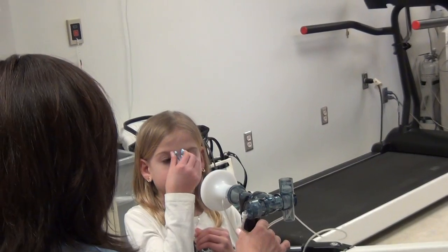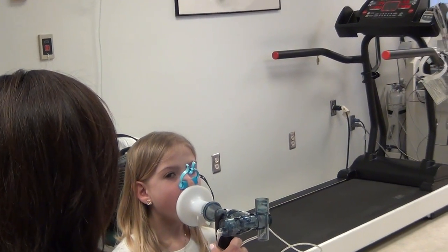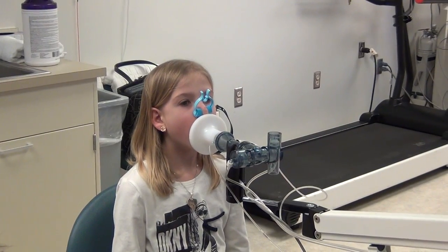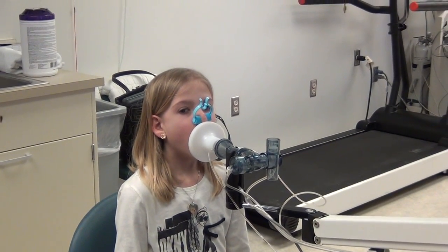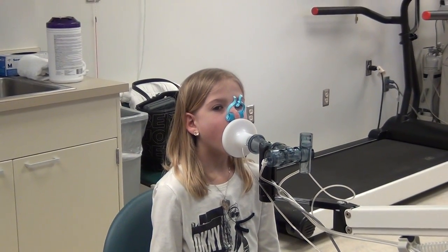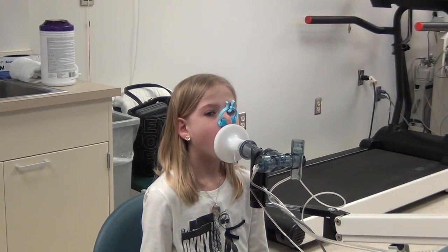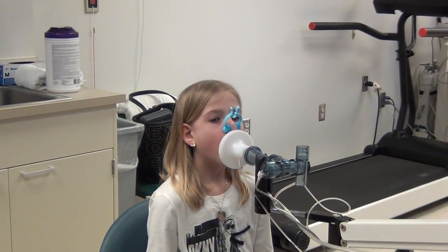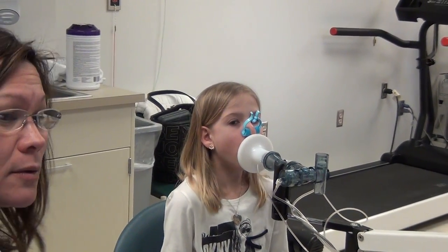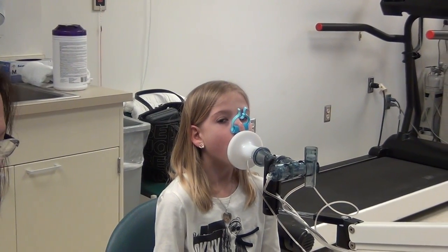This is going to go in your mouth. Nice, easy breathing in and out. Normal breathing for me. Okay, next breath — big breath in. Blow it out. Blow! Keep going. Go, go, go. Okay, come on up.